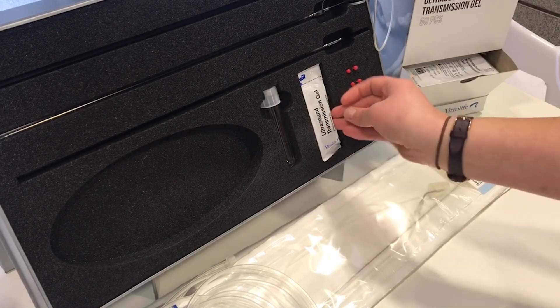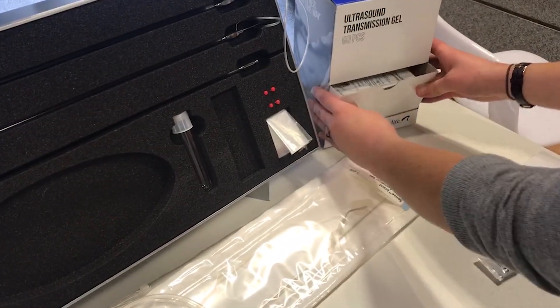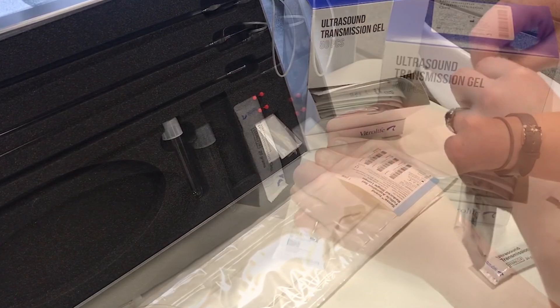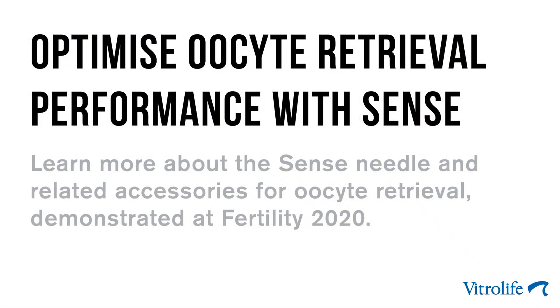Moving on to the transmission gel. The thing that's really handy is that they come in this box. For the nurses, it's very easy to take an individual pouch, which is very easy to open while in the procedure room — just like that.